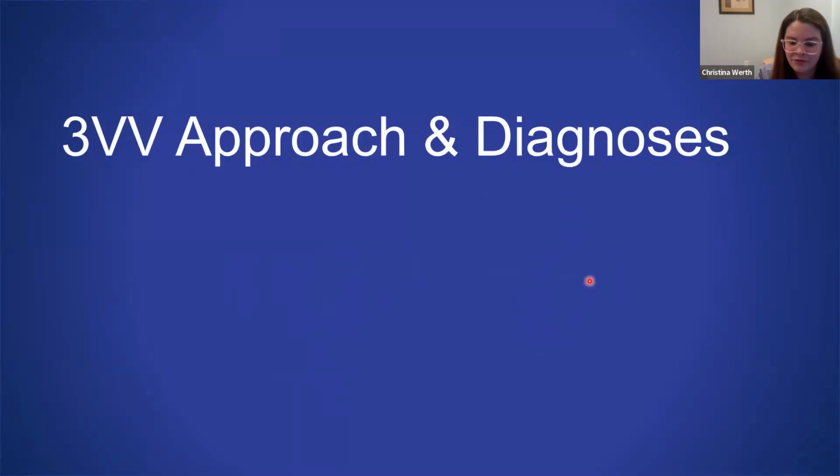All right, so that runs through some pearls and pitfalls of the technical aspects. I'm now going to throw it over to Dr. Jansen, who will begin to discuss interpretation of these views. Okay, great. Thank you so much, Christina.